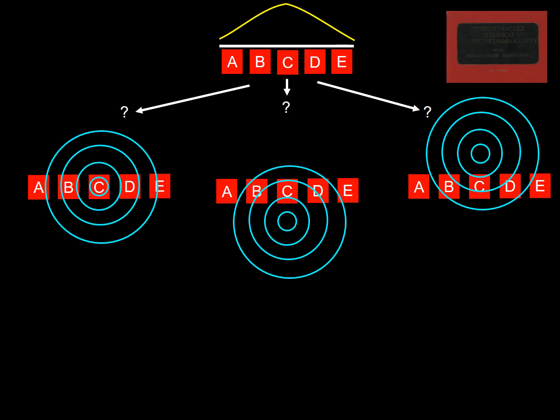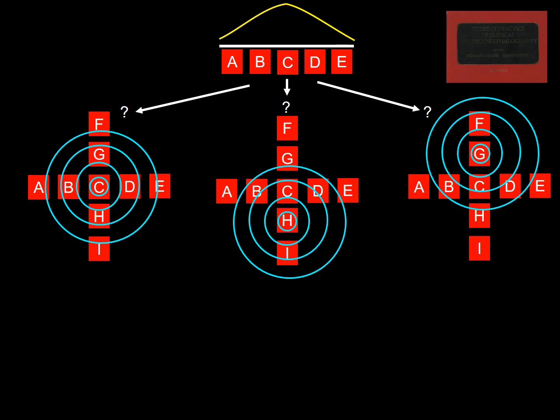The same can be said about this new added figurine. The point of all this being that using a single chain of bipolar montage, the epicenter of a field cannot be determined. Now I have introduced a new set of electrodes at a right angle of the C electrode in the figurine on the left. Now I have done the same on the middle figurine, and now on the figurine on the right.